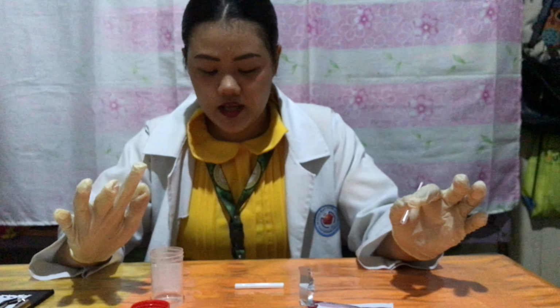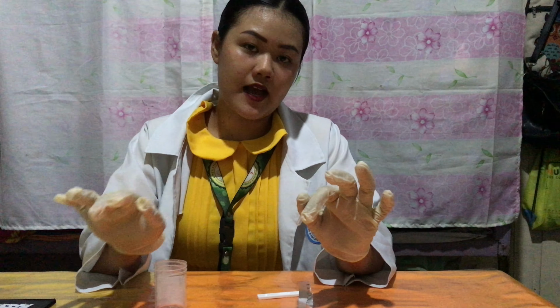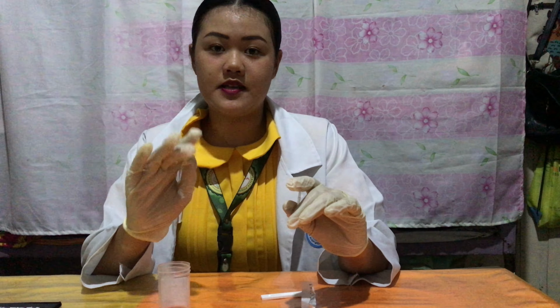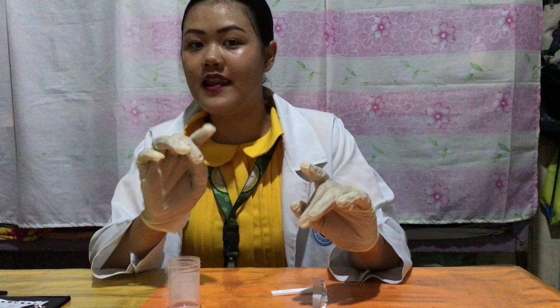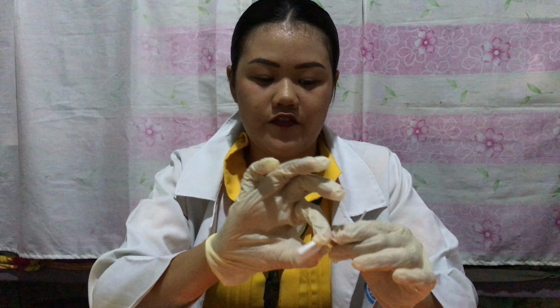While we're waiting, we will have to discuss the results. If the pregnancy test is positive, we should see a double line, or a plus sign in some pregnancy test kits. If the pregnancy test is negative, we'll only see one line. Okay, so here is the result.